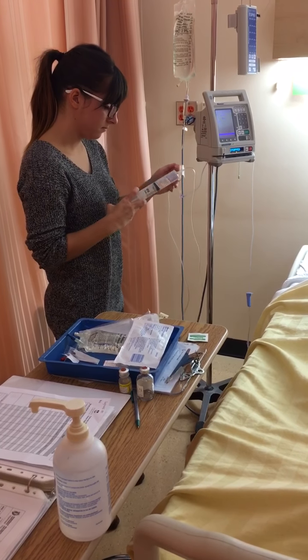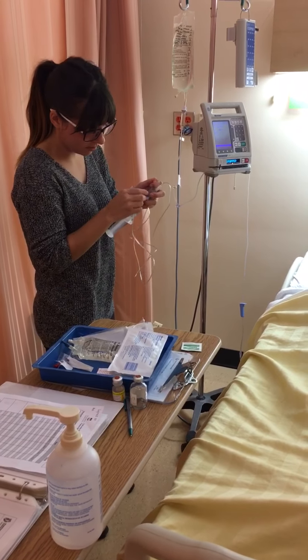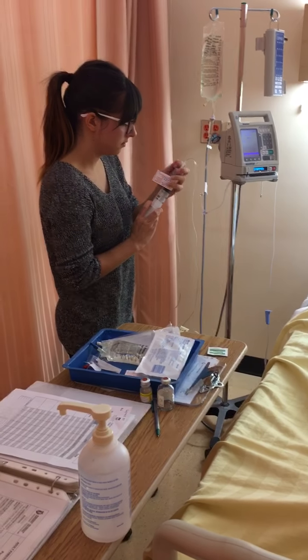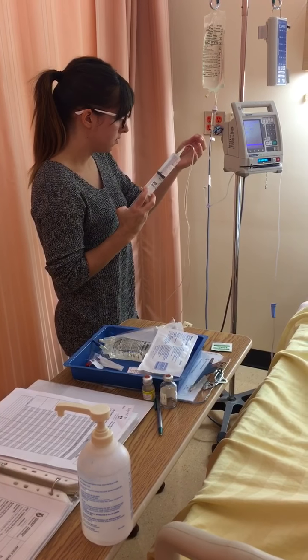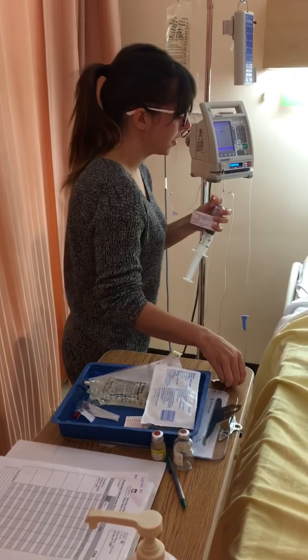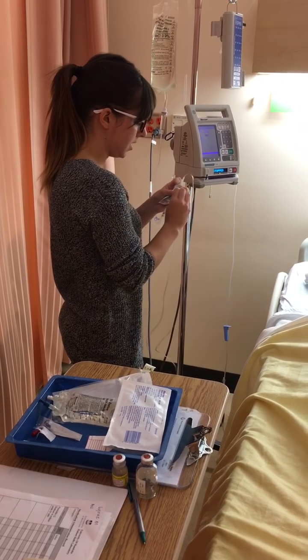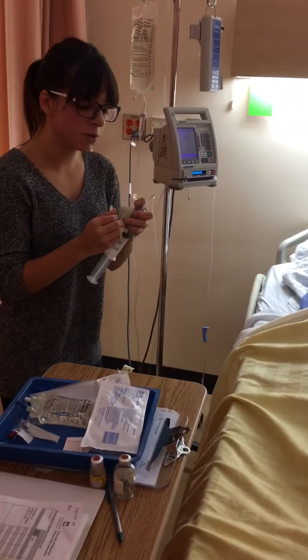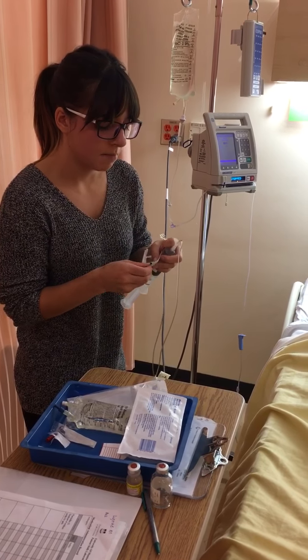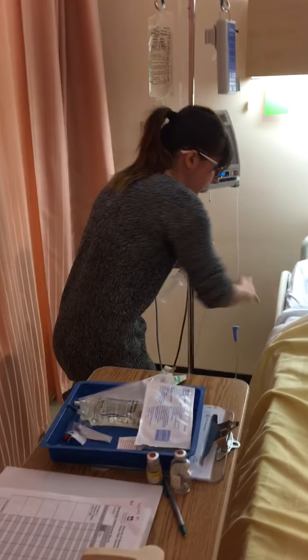Before I enter the patient's room, I'm just going to do some hand hygiene. Okay, so it's primed. Make sure that's labeled as well. I'm going to make sure that I keep this sterile, and I'm going to be swabbing the port closest to the patient, because we want this medication to go in on its own.